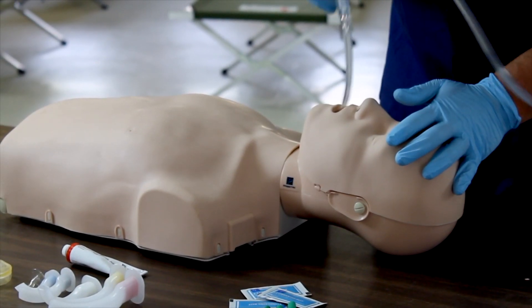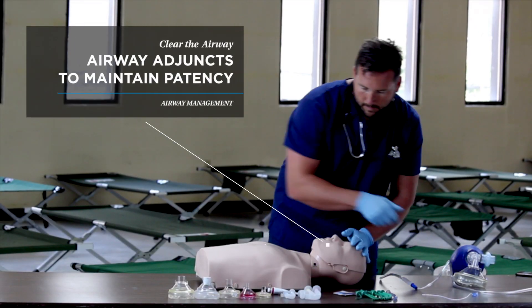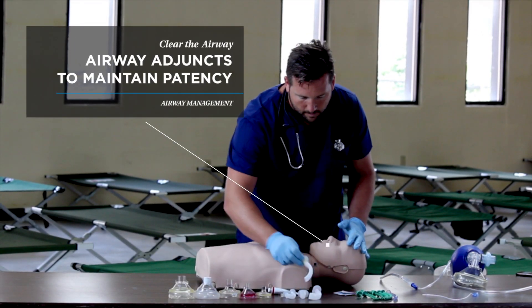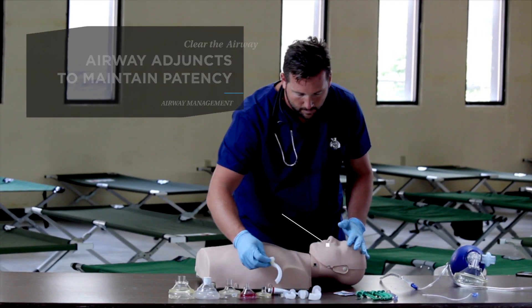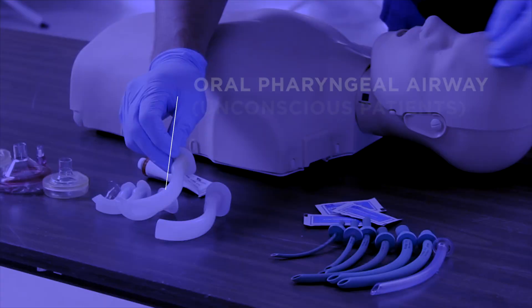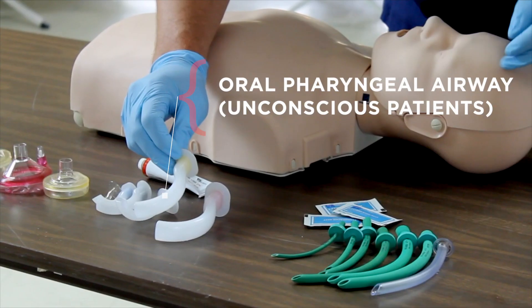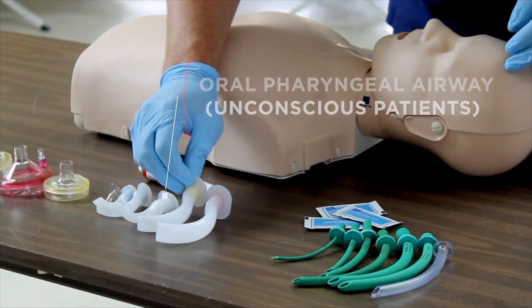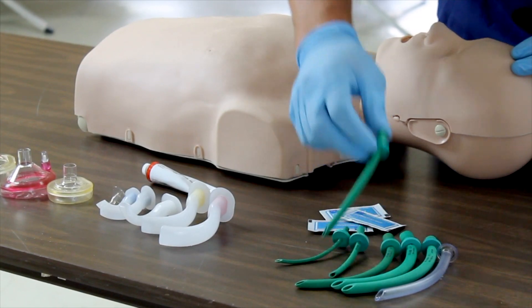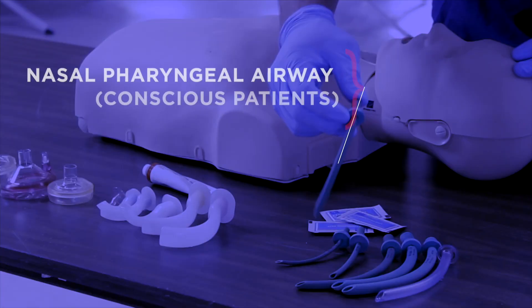Now that the airway is open and clear, consider a couple airway adjuncts to maintain patency. There are two main types including the oral pharyngeal airway for unconscious patients and the nasal pharyngeal airway for conscious patients.